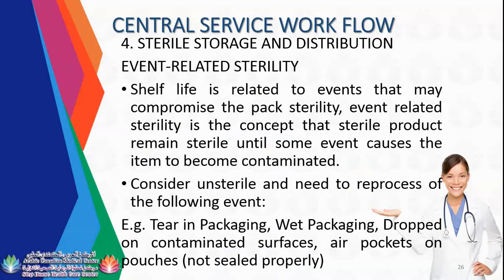Guys, there are two types of sterility of your instrument: the event-related sterility and the time-related sterility. Time-related means there are intended months when your instrument will expire. In DOH, in Abu Dhabi, they are implementing the 3-months rule. Some countries are using 1 year. It depends on each local regulation authority. Sometimes they are using 3 months, 6 months, 1 year. It depends. The event-related is different.